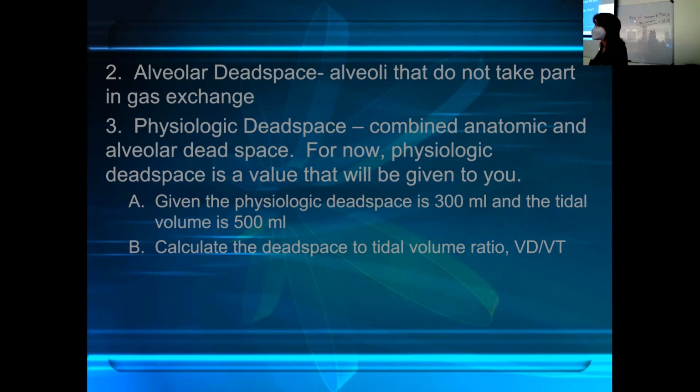Is there a critical number on the low side, or is anything below 30? Anything below 30. Critical? No. Okay, so if 30 is normal, but we're not concerned till it's 50, on the opposite way, if it's 25, are we concerned? No, it just means that the patient's taking in a really deep breath. Yeah, that's okay.